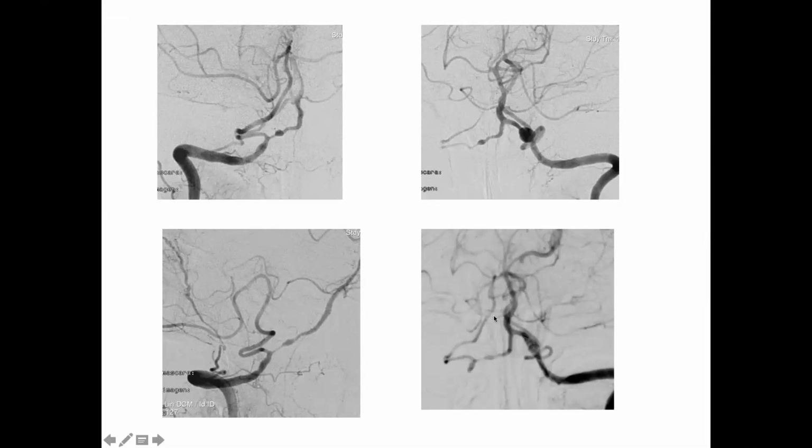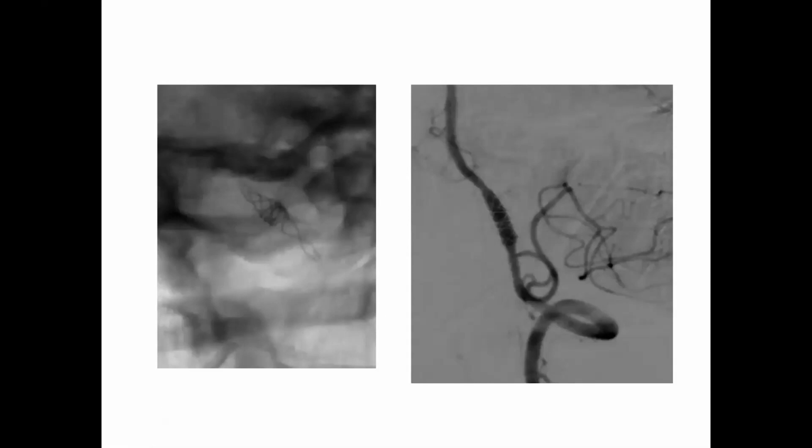When I finished the treatment, I checked the right side aneurysm and saw a decrease in the size of the aneurysm. Probably it is the phenomenon of the Bernoulli effect. You have higher flow on this side and less flow on this side. I don't know why, but the flow changes in the region. 1 month later, the aneurysm is totally reconstructed.